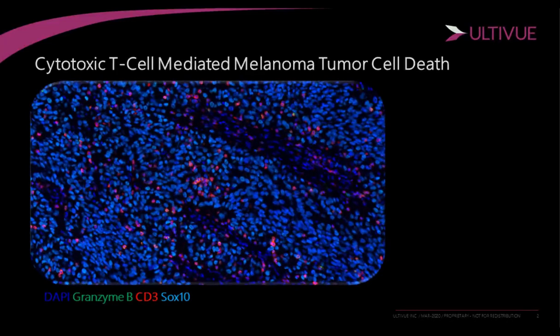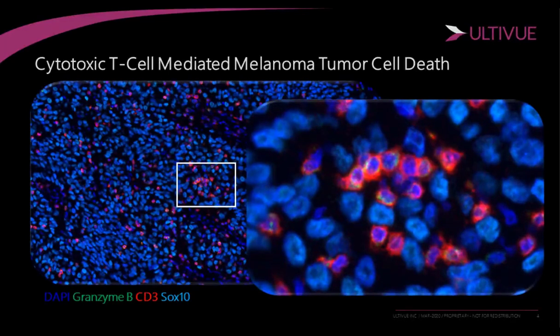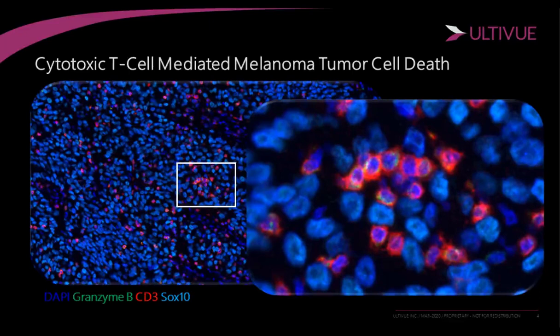What you're seeing is DAPI in blue, Granzyme B in green, CD3 in red, and SOX10 melanoma tumor marker in a light blue cyan color. Within this melanoma, we are capturing a biological event by visualizing cell-to-cell interactions in context while maintaining spatial resolution. I'm going to zoom into a very specific region within the center of this image. Here we can see the immune response with a cytotoxic T cell recognizing and preparing to attack an abutting tumor cell.